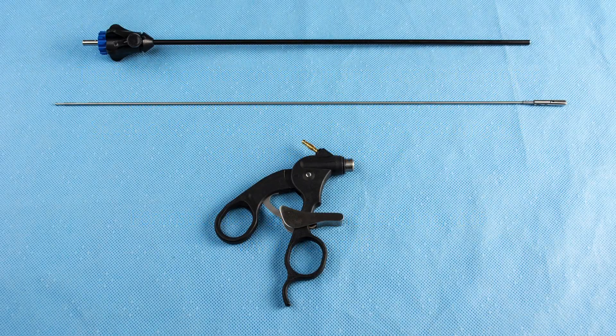AED Speedlock Laparoscopic Instruments are comprised of three parts: an insulated shaft, a jaw insert, and a ratchet handle.